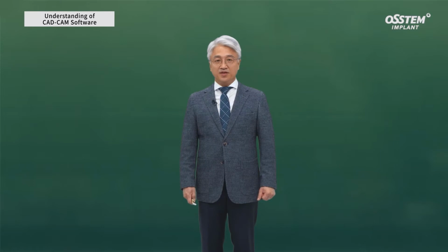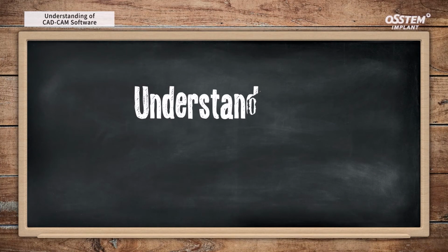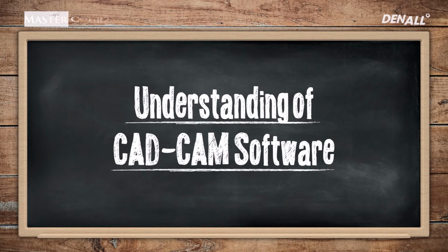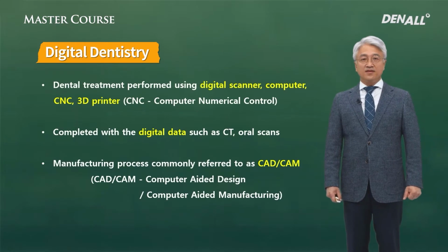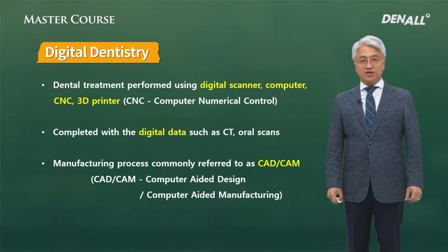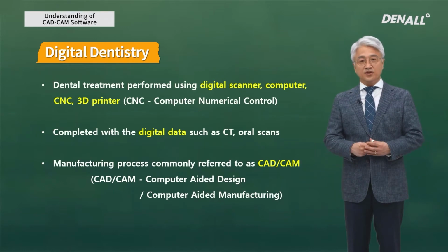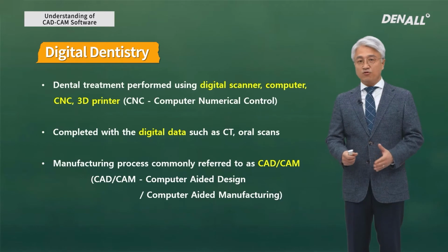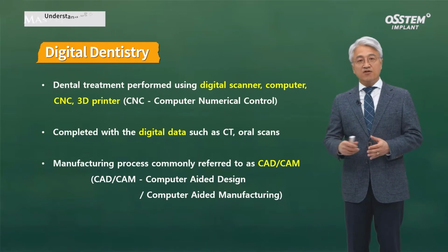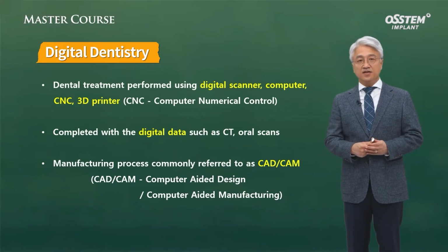Today I'm going to talk about CAD-CAM software in depth. Digital dentistry encompasses all dental treatment performed using a digital scanner, computer, CNC, and 3D printer. The entire process can be called digital dentistry. Data such as oral scanner and CT data are used to proceed with all processes. Under the name CAD-CAM, all manufacturing and fabrication processes proceed.